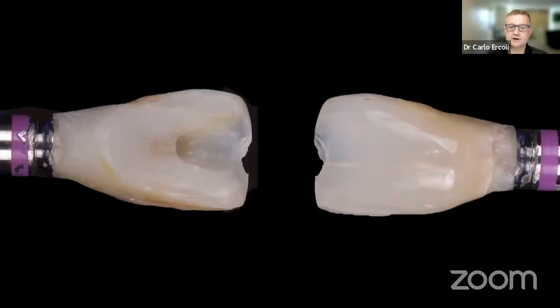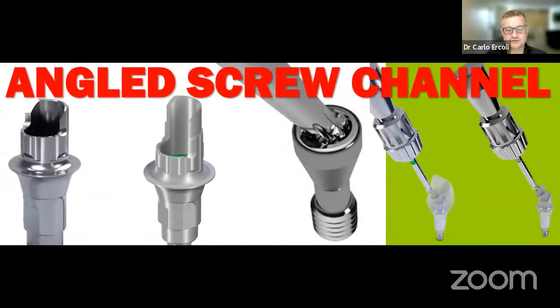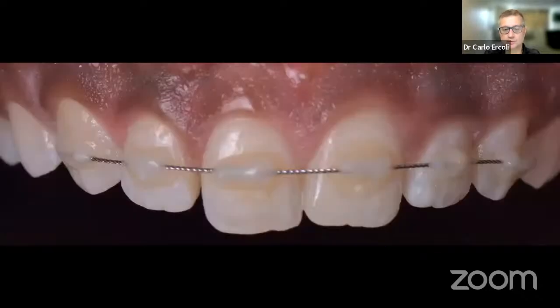One thing that is important is to realize that in this temporary restoration, often the screw access hole is very, very close to the incisal margin of your tooth. While that is not a problem in the temporary restoration, the lab is going to have a very hard time having a very, very thin layer of porcelain in that incisal area, which often will really look not right. So we need to re-angle, redesign the inclination of the screw channel. And often we use components that we call angled screw channel abutments, that allow the engagement of your screw with a different angulation of your screwdriver and a different type of screw. A large number of the manufacturers all have this type of solution. By doing so, we are redirecting that screw channel in the most ideal situation towards the palatal side. Let's look at other cases like this one over here.